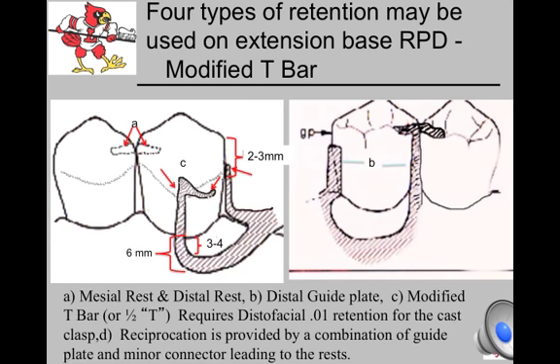The plate is relieved in the gingival 4 millimeters to allow for debris and plaque to escape on the buccal or lingual rather than pack food into the sulcus. It also allows the plate to rotate toward the tooth when a force is applied to the distal extension area of the prosthesis.